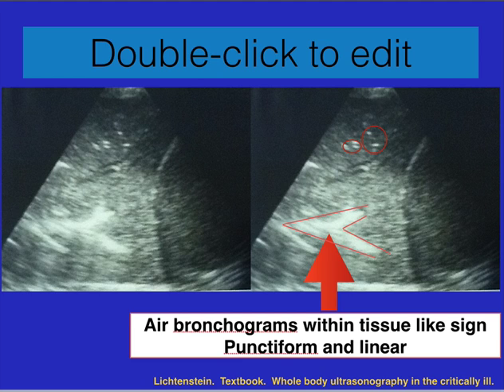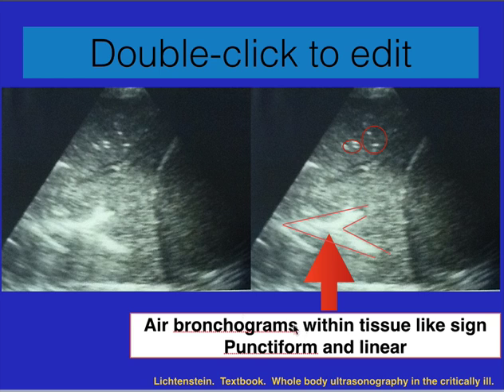If you see air bronchograms within the tissue, they can be either punctate or linear. You can see the bottom here is linear, and these are little punctate ones. This would indicate either early pneumonia or a pneumonia process. Again, you have to look at the clinical process and context that takes place with it.